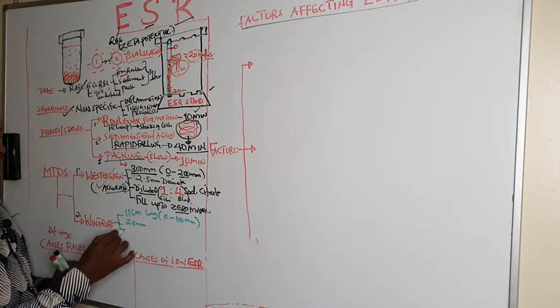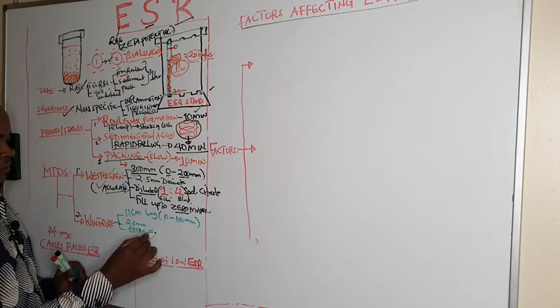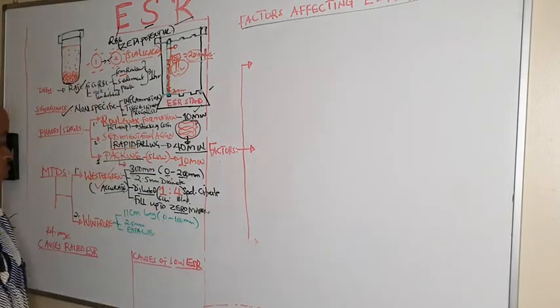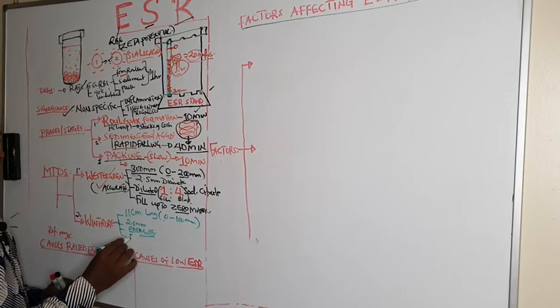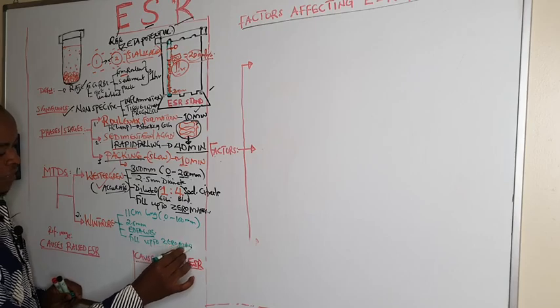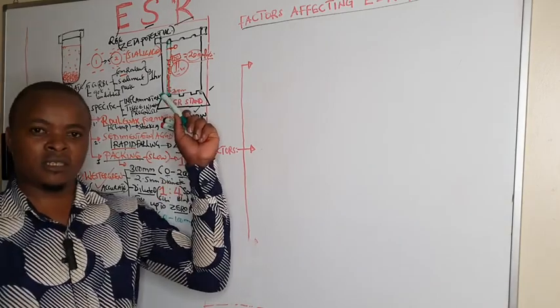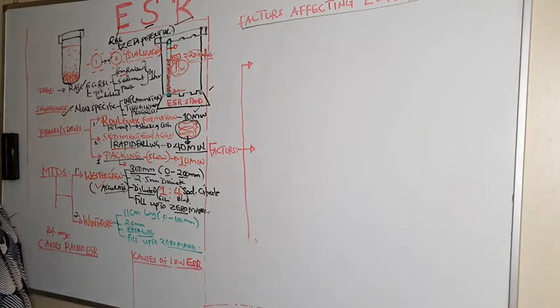And with this one, we use EDTA whole blood. Here there is no dilution using sodium citrate, so we use EDTA whole blood. After getting this, we fill the tube up to the 0 mark, and then we leave it to stand in a vertical position for 1 hour, and we come and read the ESR results.